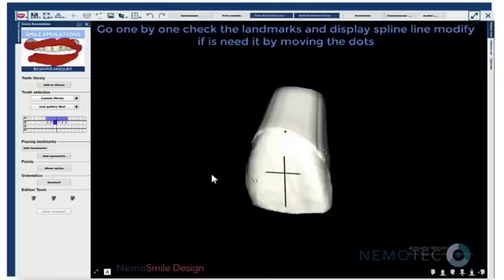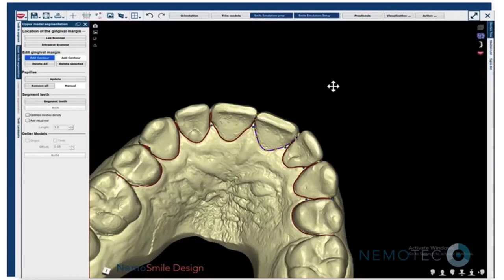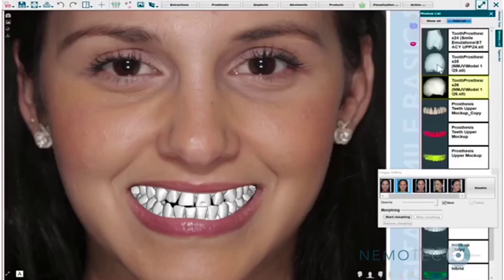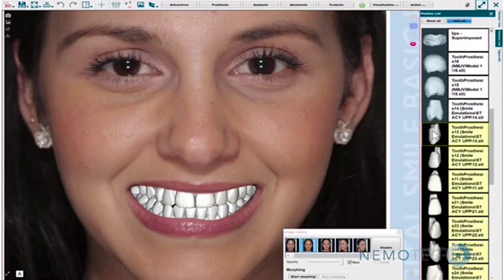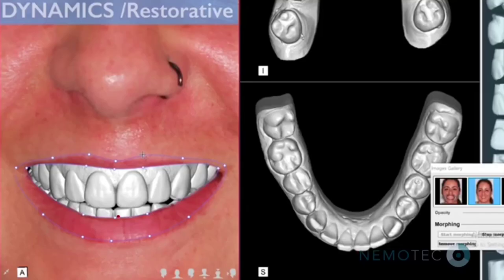Smile Emulations is the new setup that we launched to facilitate the creation of Smile Galleries. We are utilizing the fantastic tools we have for automatic segmentation to create different workflows that will allow you to create the smile of your dreams.